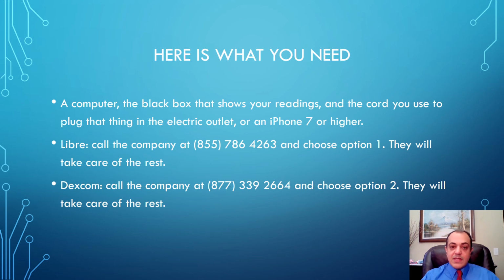For Libre, this is the number to call. Choose option 1. They will take care of the rest. For Dexcom, you call the company at this number and choose option 2. They will take care of the rest. I hope that makes it very simple and straightforward.